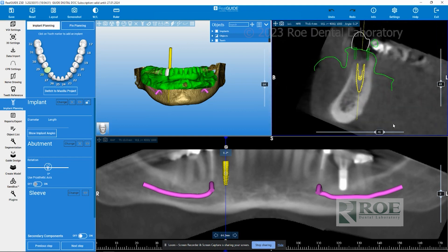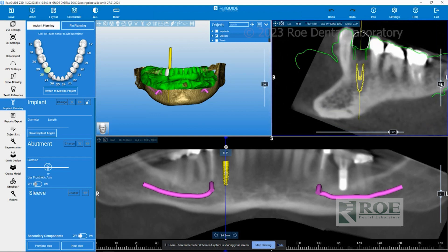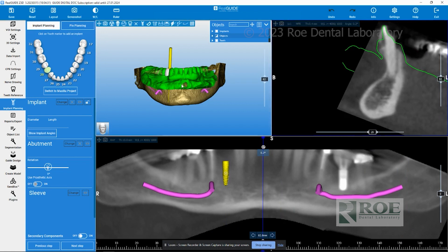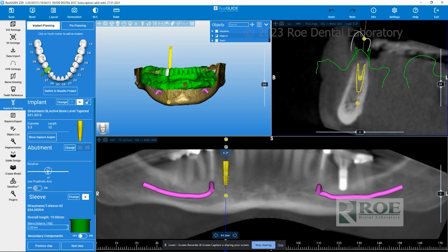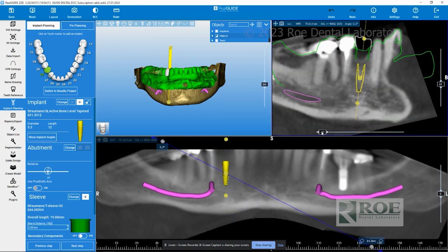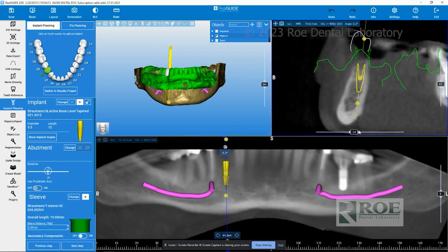If you ever find yourself having clicked the wrong buttons and can't find the implant, come back over to the tooth chart. Click on the tooth where the implant is — in this case, number 28 — and it'll take you back to center on the implant. You can then click and hold your left mouse button to go around the implant and see all the different views.